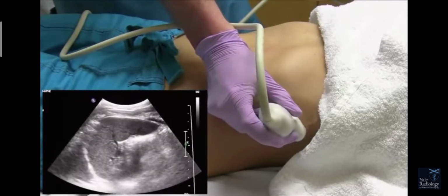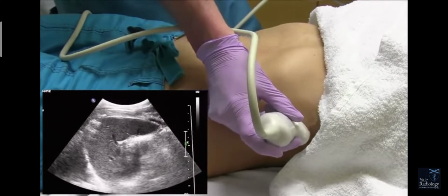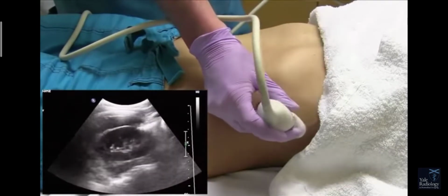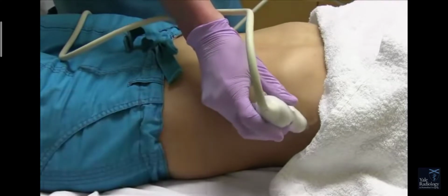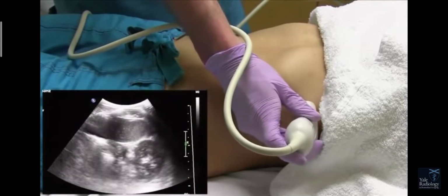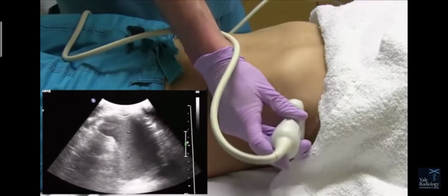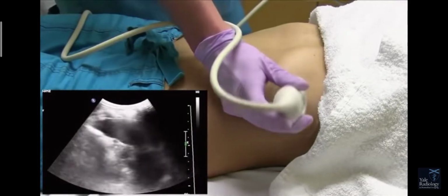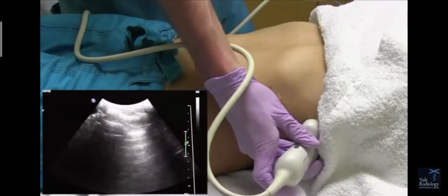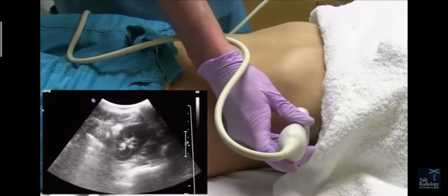Once you get to the maximal dimension of the spleen, we usually measure the length of the spleen in this window here. And you sweep through the spleen completely in sagittal images of the spleen. You may see some of those rib shadows in your view, but all you can do is angle, maybe come a little more anterior or posterior to get around those ribs, and just sweep through as much of the spleen from these different windows as possible until you feel like you've seen the entire spleen.